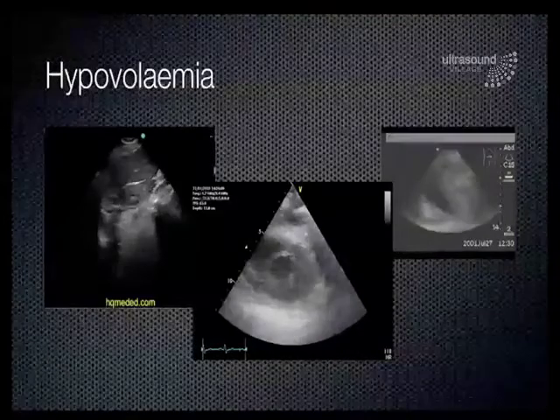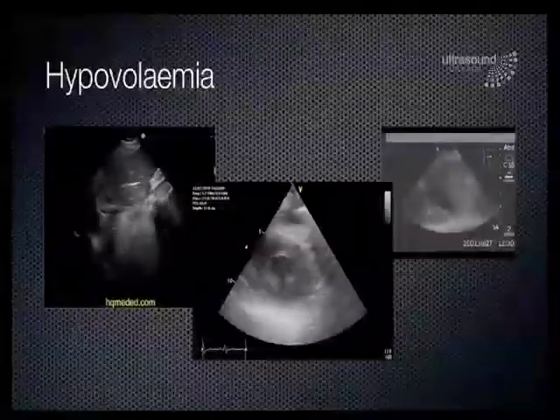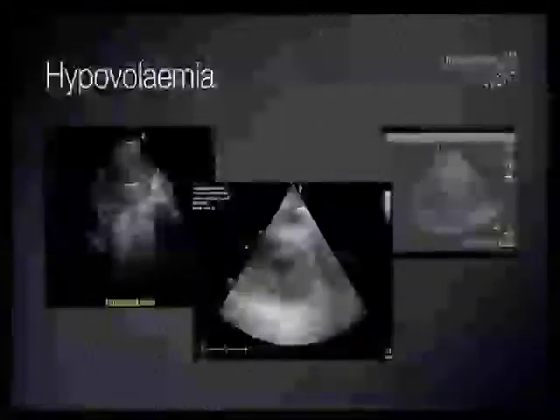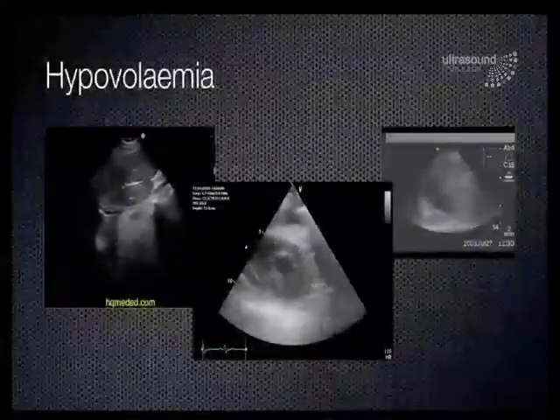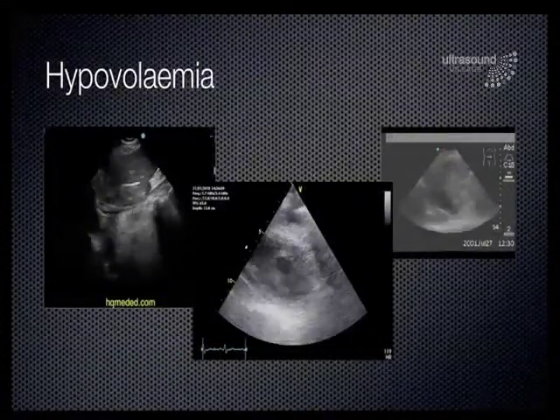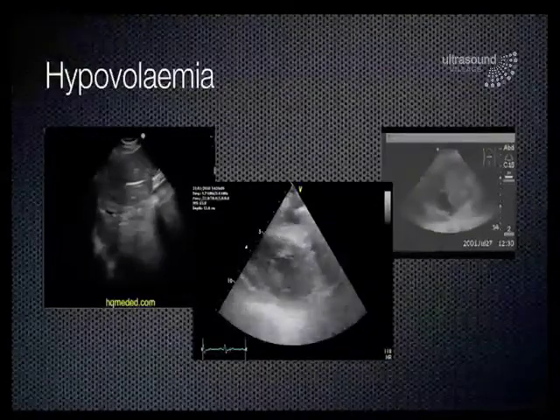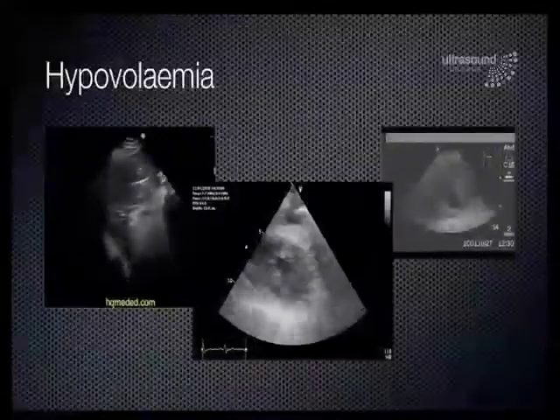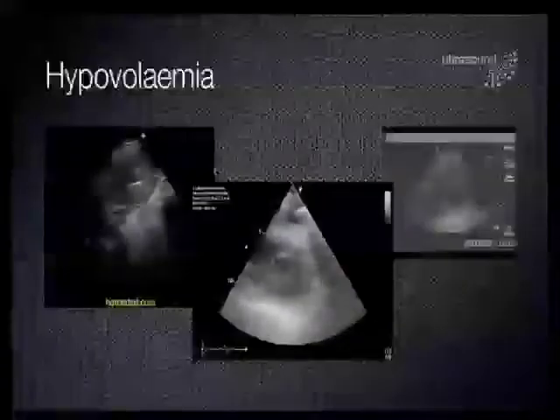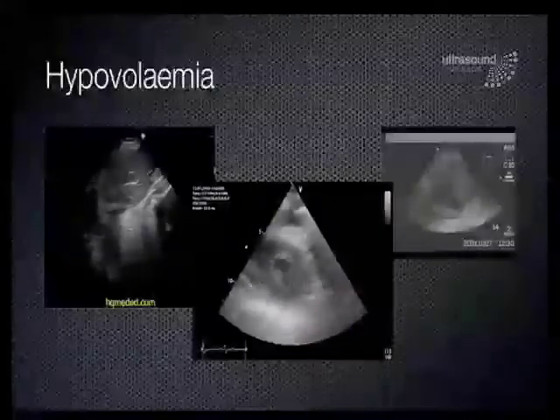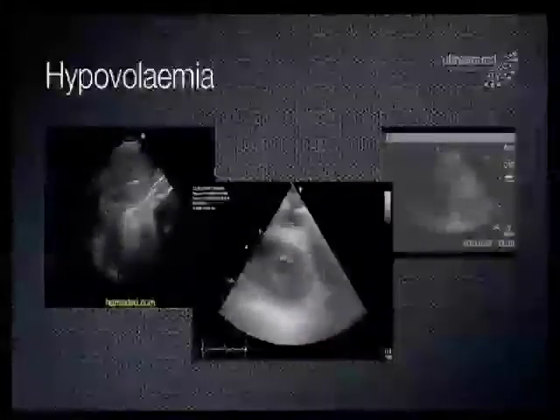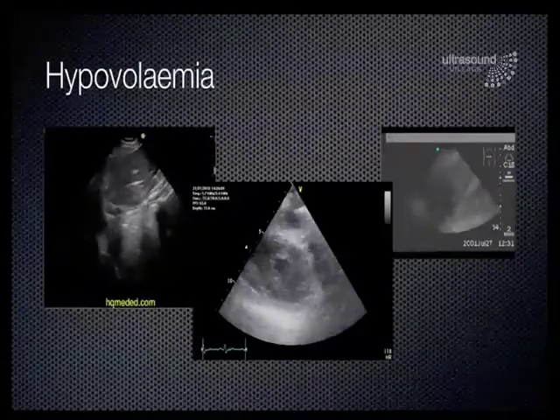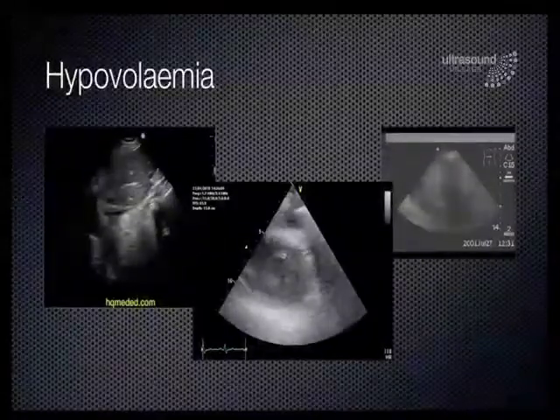In this example, three separate clips from left to right show: firstly a collapsed IVC indicating a hypovolemic state, in the middle a hyperdynamic left ventricle, and on the right a FAST scan left upper quadrant showing fluid around the spleen.